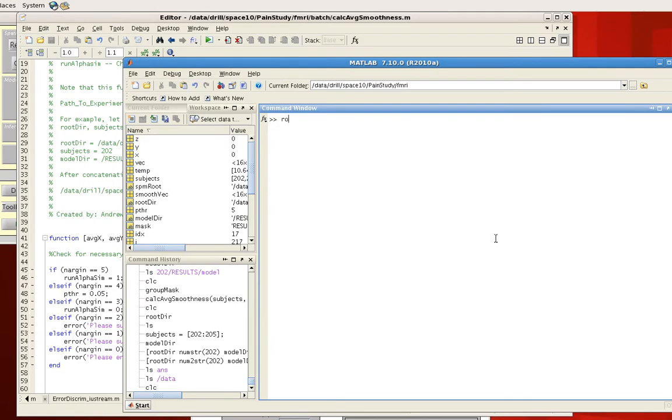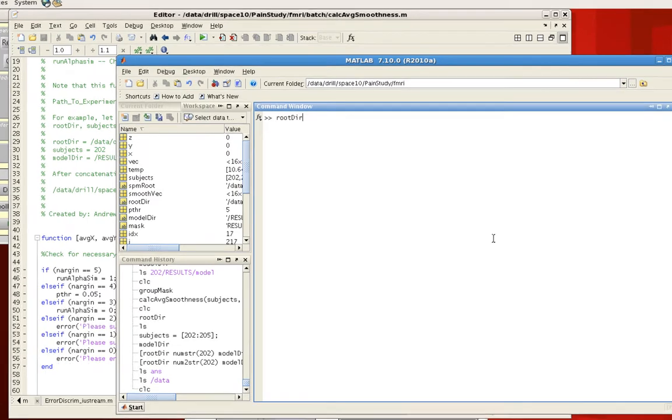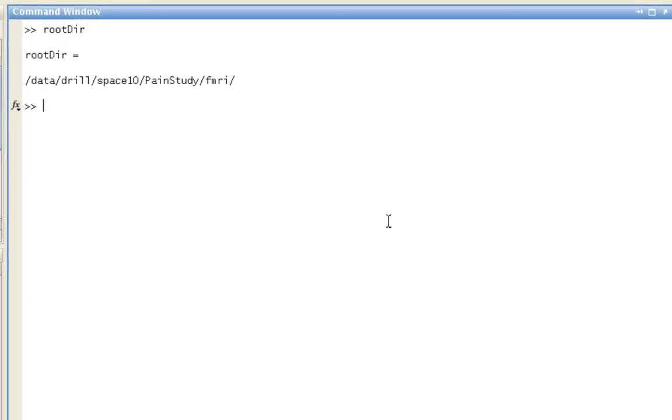I'm going to show you what these different variables look like, and this is specific to the way I have my study set up, so feel free to modify them as you want. First of all, rootdir points towards where all the individual subject directories are.